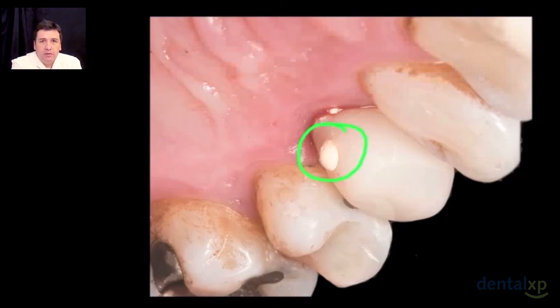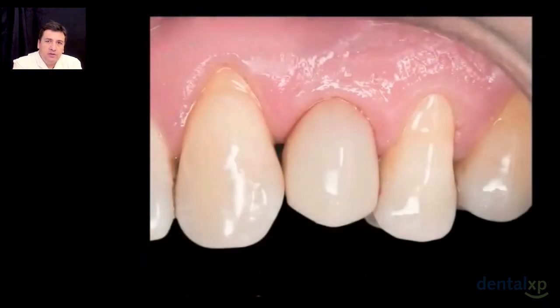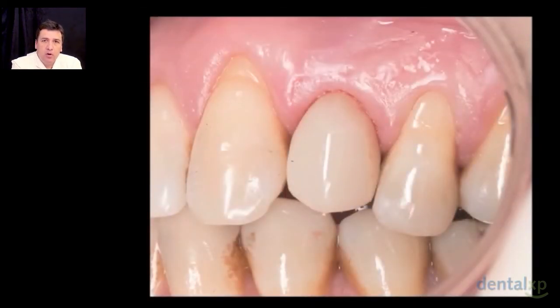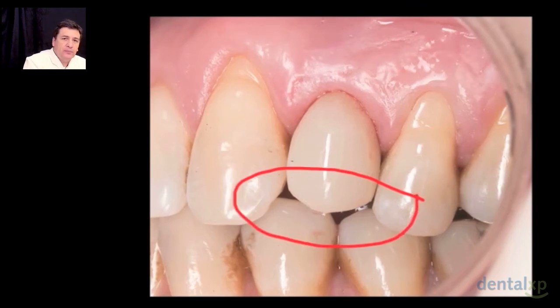That is a very good treatment option, and that will ensure that the soft tissue will heal in a proper way without any foreign material like we are seeing right now. The little black triangle will persist until we go with the definitive crown, because in the definitive crown we will be able to give a longer contact point, a better tooth anatomy, etc.